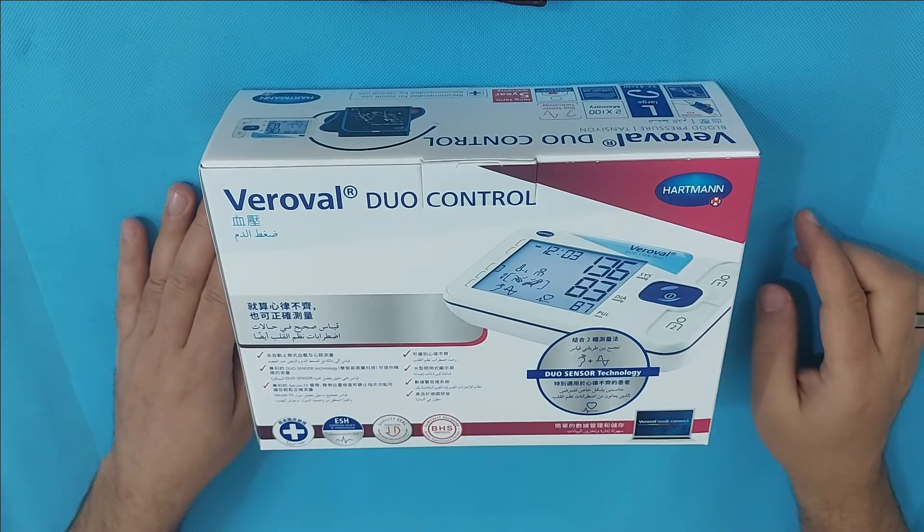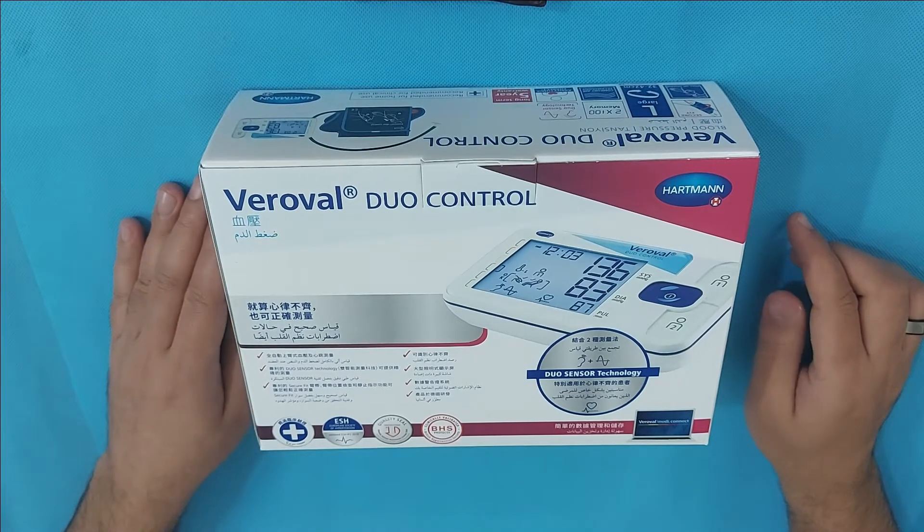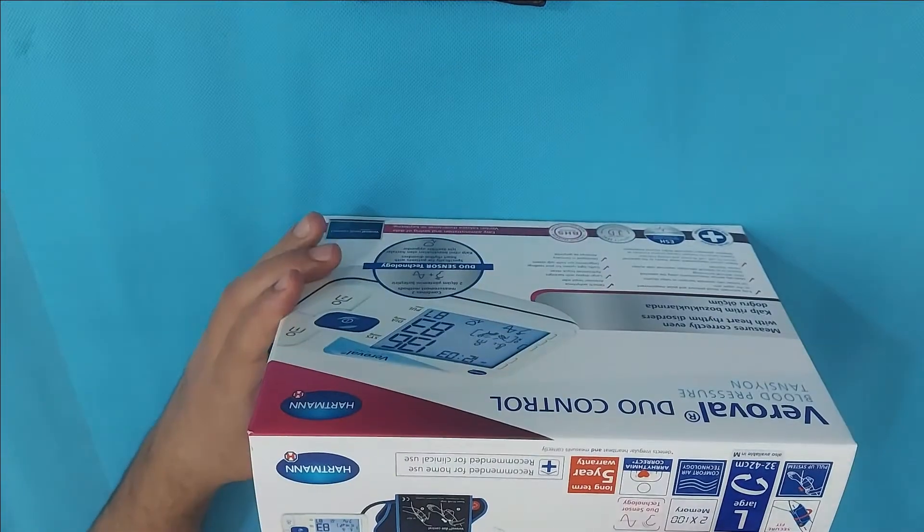This is a Veroval Duo Control Blood Pressure Monitor. In this video, I will go over the key features of this blood pressure cuff.